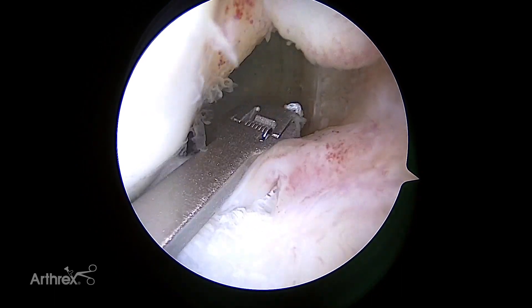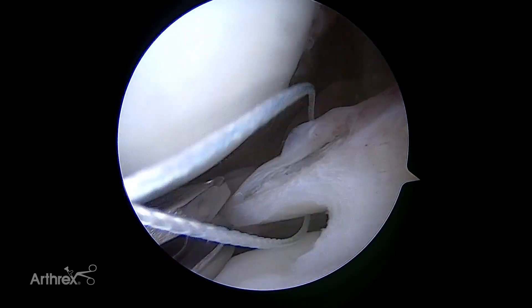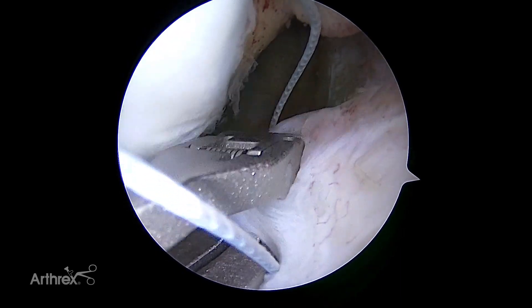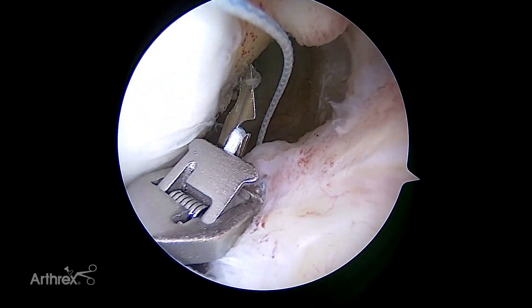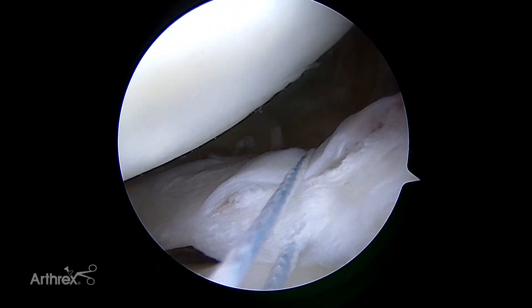The FastPass technology allows the Knee Scorpion to retrieve the suture easily. As the Knee Scorpion is reintroduced into the cannula, pull slight tension on the other suture limb to prevent it from inadvertently becoming entangled or trapped in the jaw. When the device is positioned for optimal suture passage, simply squeeze the trigger to pass the suture.